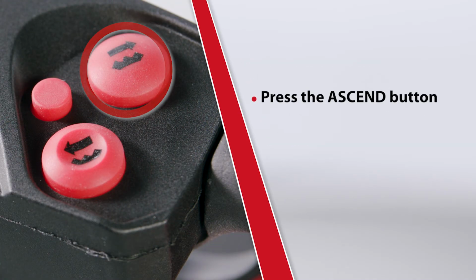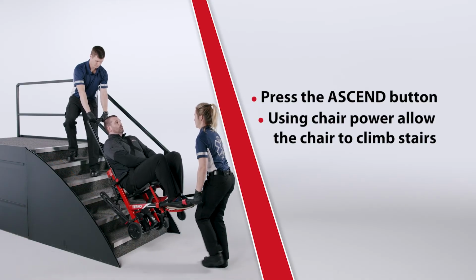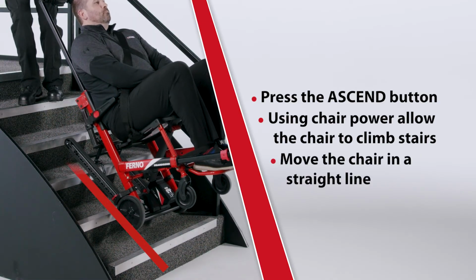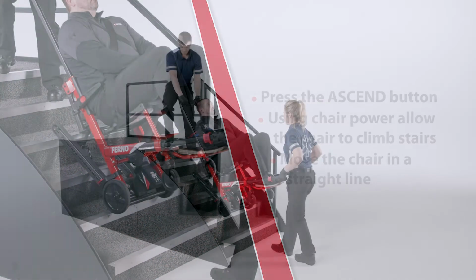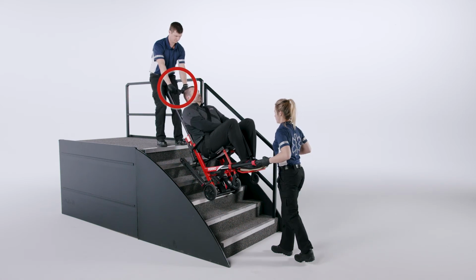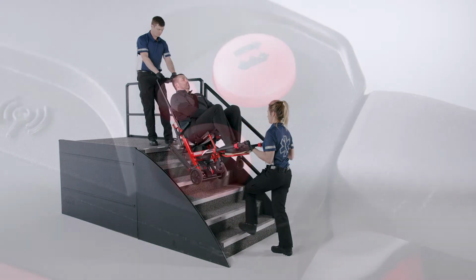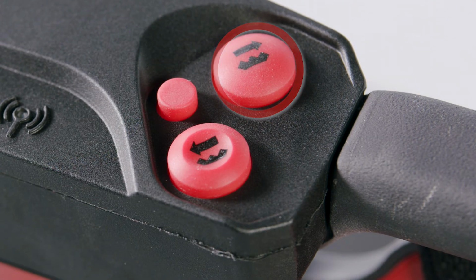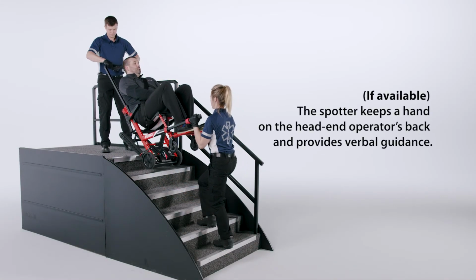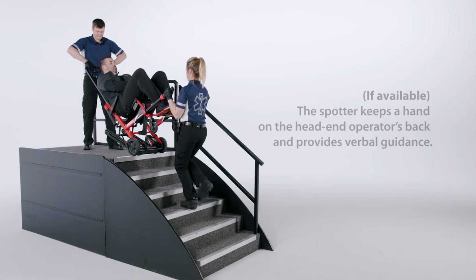Press the ascend button and using the chair's power, allow the chair to climb the stairs until the tracks engage 2 or 3 steps. Move the chair in a straight line, allowing the motor to do the work. To maintain the glide angle, apply slight downward pressure on the lift bar and slight upward pressure on the foot end lift handles. The operator should continue pressing the ascend button while transporting a patient up the stairs. The spotter, if available, keeps a hand on the head end operator's back and provides verbal guidance.